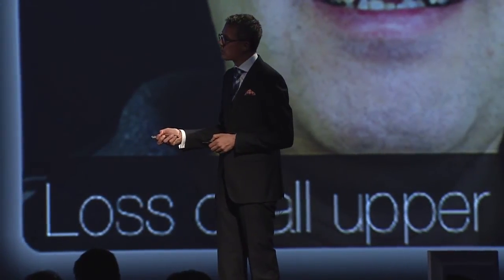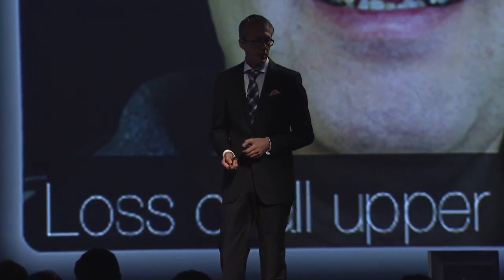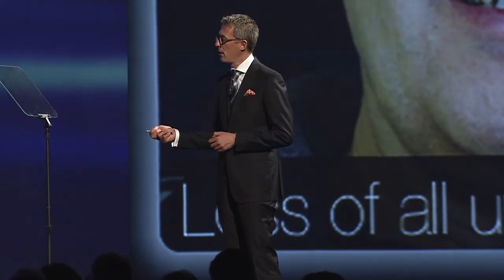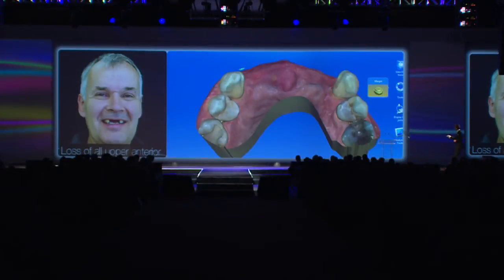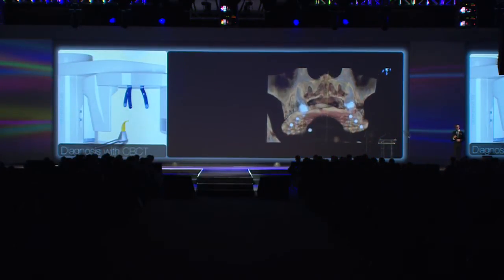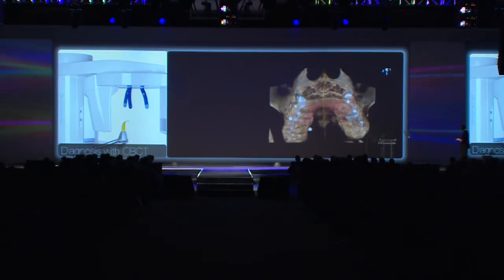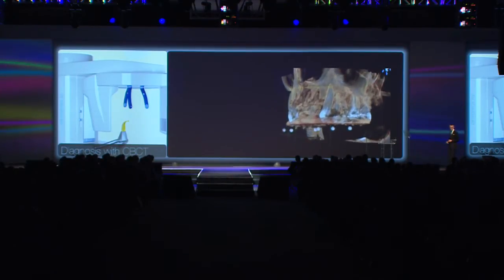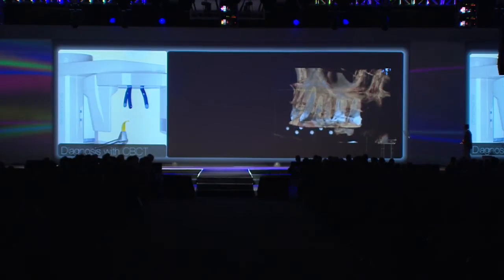And this was an indication for implant restorations, because he doesn't want to have a removable prosthesis. So it's not that easy to, let's say, solve such a case. We need a proper implant planning, we need a proper prosthetic planning, and after removing the broken teeth, after a healing period of about 6 to 8 weeks, we did the cone beam CT in order to check how much bone is available for implant restorations.